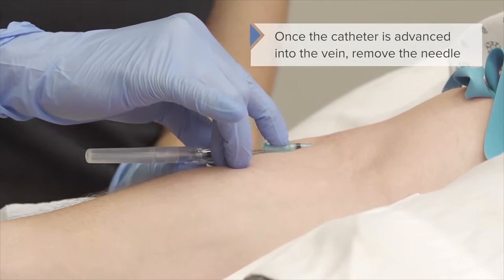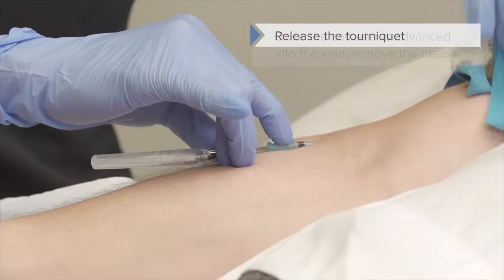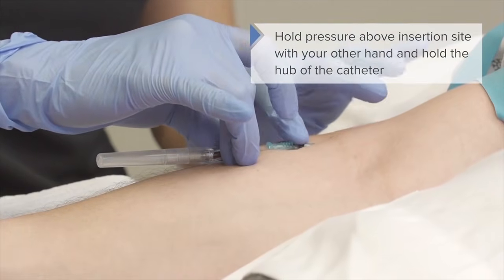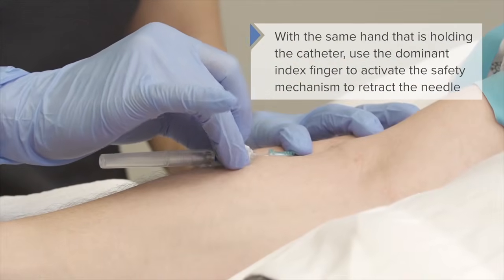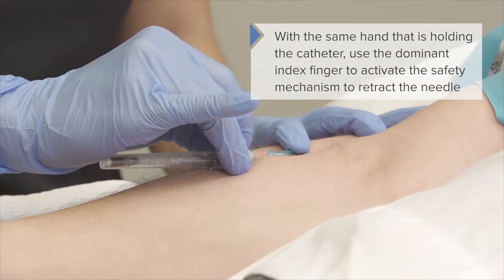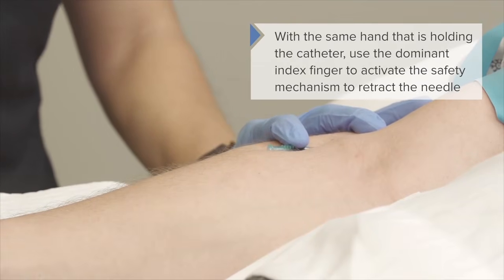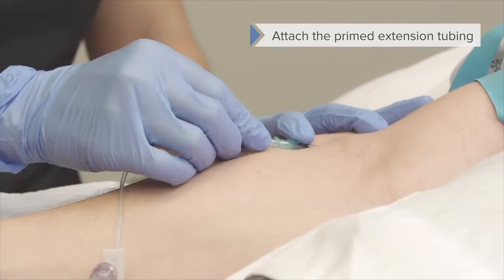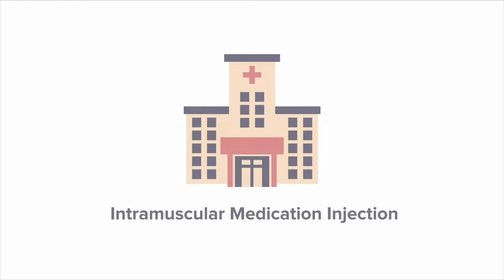Now once I've done this, this is where it's going to go fast. So you want to make sure we release our tourniquet. I want to make sure I hold on to my hub so I don't lose my site and hold down on pressure. I'm going to push my ejection button and I'm going to release the needle. Then at that point, this is where I'm going to go ahead and put on my pigtail here.